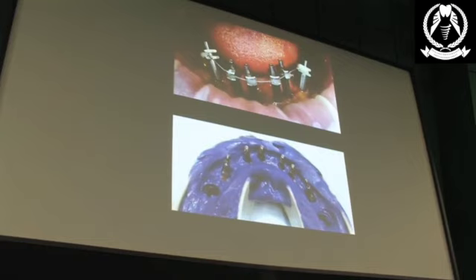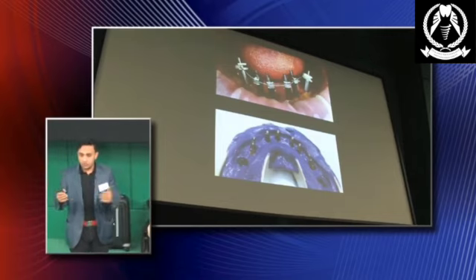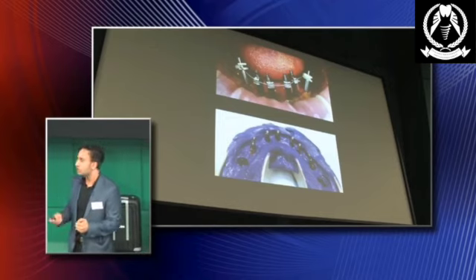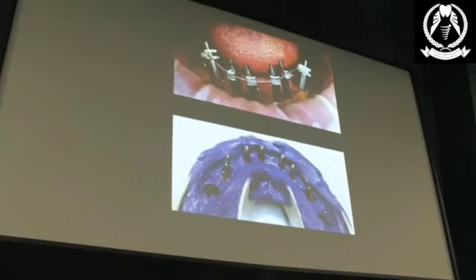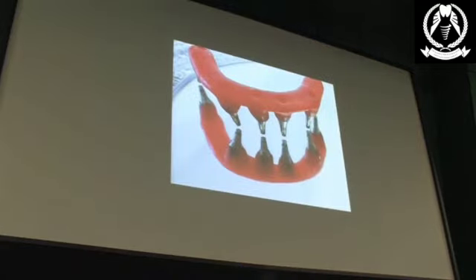After a period of healing, osseointegration takes 4 months on my patients. That's the time it takes when you put that titanium into bone for those cells to fuse to that titanium, and that becomes solid and ready to put a final bridge on. So we took some impressions. These things at the top here are called copings. They're screwed into the implants and they triangulate the 3D position to your ceramicist. These are then made by your lab and positioned, and they're called abutments. They go into your implants, and they will provide the stable cores for your bridge.